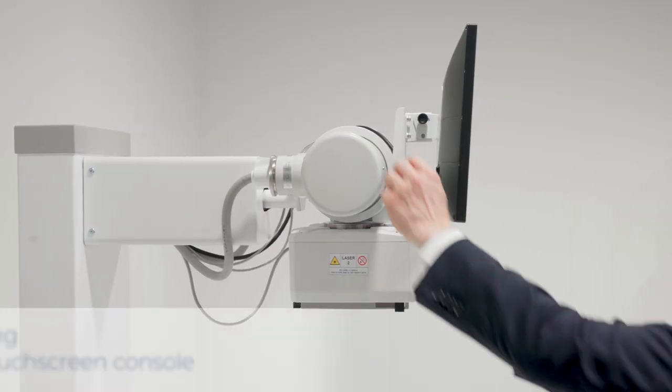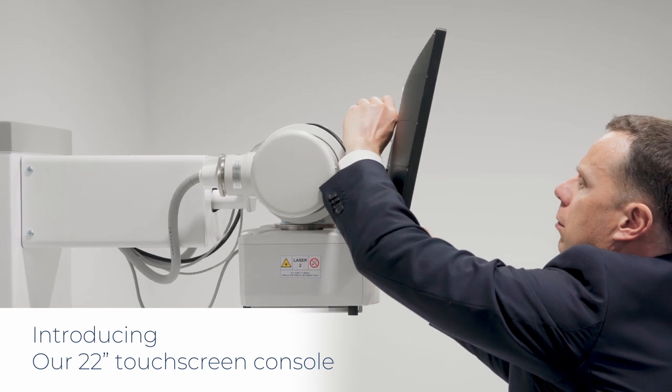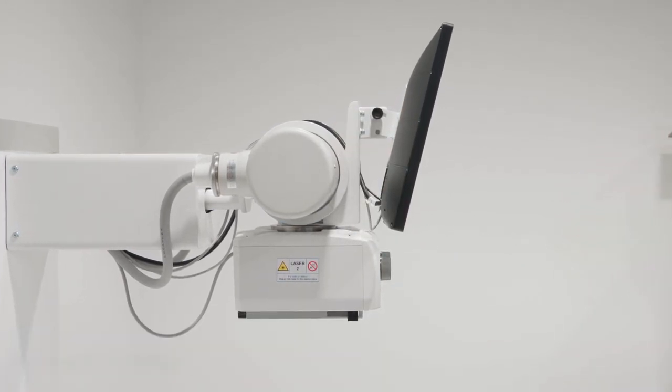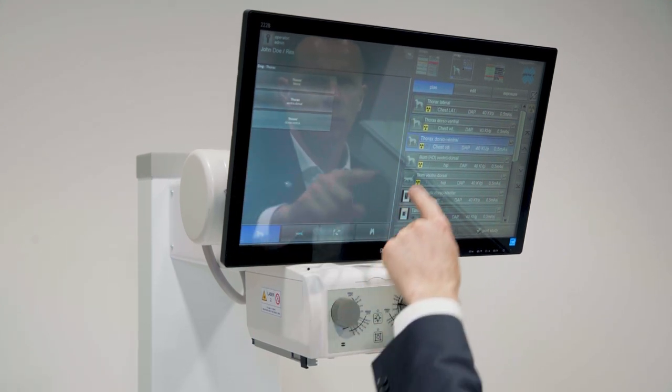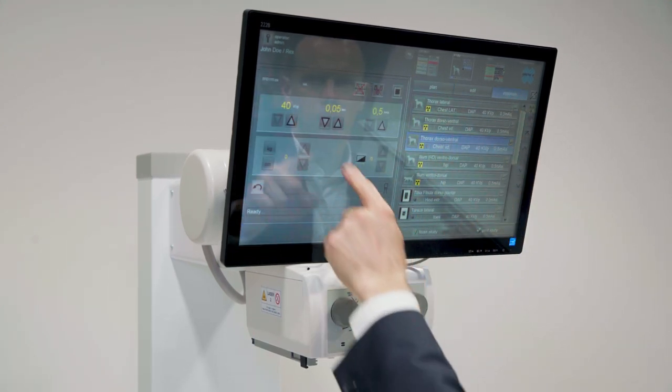The tube head can be mounted with three different control consoles. First, there is a brand new 22-inch touchscreen monitor console which can be used to set exposure parameters and for full image capture and analysis.